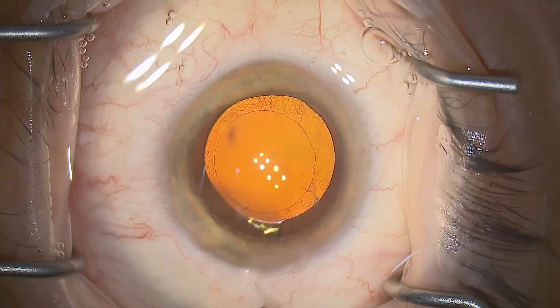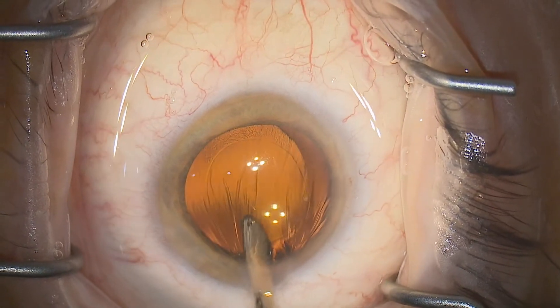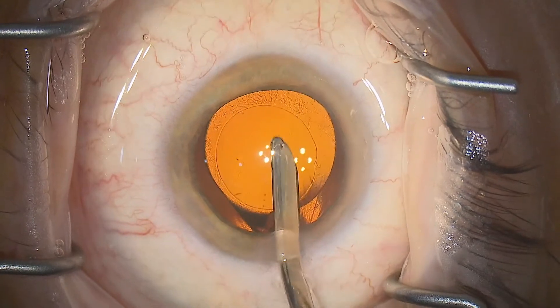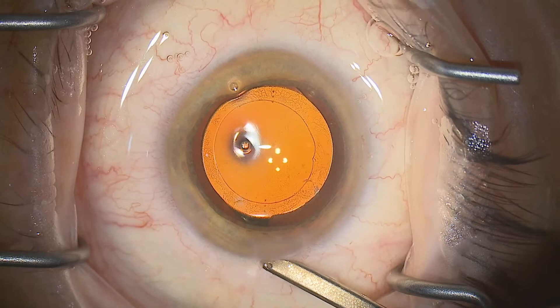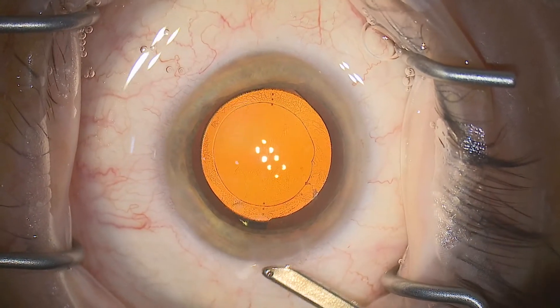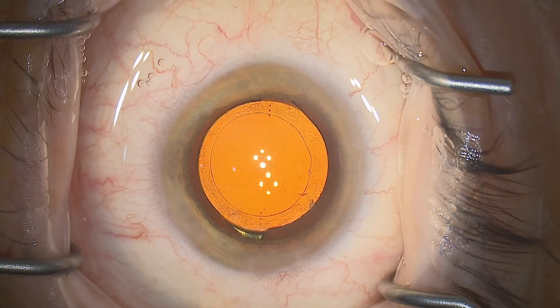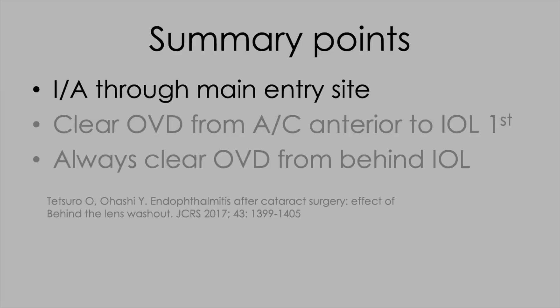You can adapt your technique with other IA systems, but the Simcoe is a very safe place to start. Having achieved a complete clearance of viscoelastic at the end of the operation and having fine-tuned the position of the lens optic, you're ready to bring the eye to physiological pressure to check the entry site. A quick way to do that is just to kiss the external ostium of the main entry site with the Simcoe, and that brings the eye up to pressure very quickly.